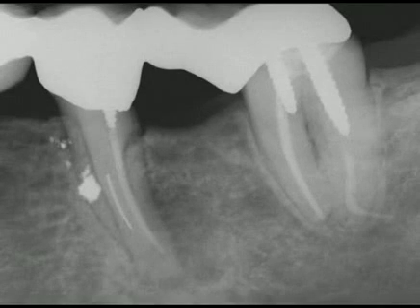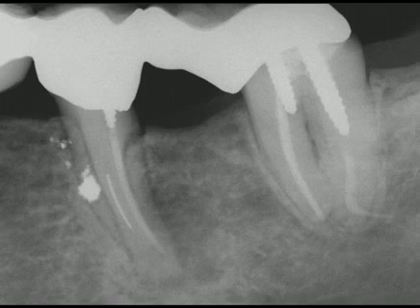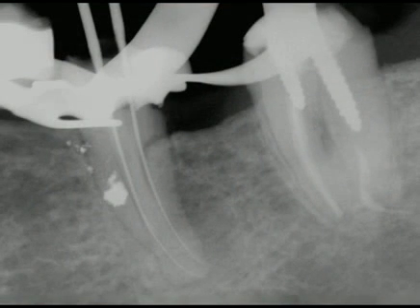Here's a preoperative radiograph of a hemisected molar and the remaining mesial root is endodontically failing. Note a short screw post, a separated instrument, and amalgam debris from the previous surgical procedure. A clinical photograph shows the splint removed, the post out, and an ultrasonic instrument trephining around the broken file. A subsequent working film demonstrates 2 instruments negotiating the MB and ML systems and at length.